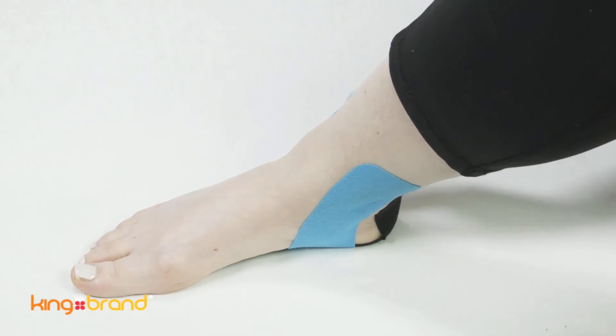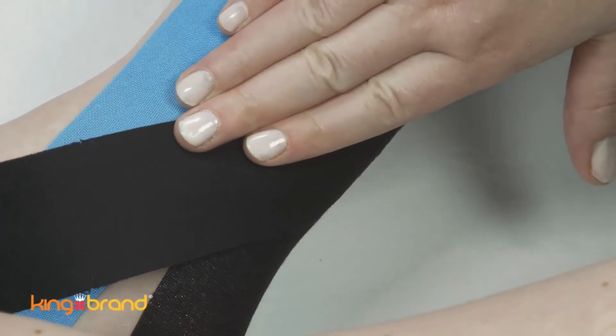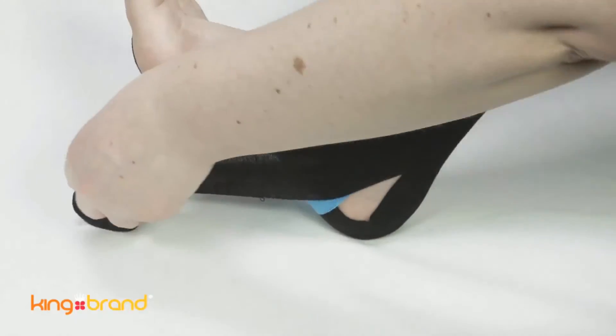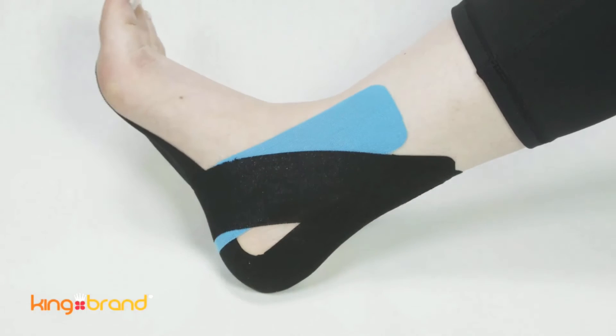Take a third piece of 10-inch support tape and anchor it at a 60-degree angle, just below the second piece of tape you applied around the ankle. Apply the tape with no stretch until you reach the ankle bone. Then, use full stretch to wrap the tape around the bottom of your foot and up the other side of your ankle. The tape should look the same on both sides of your ankle.